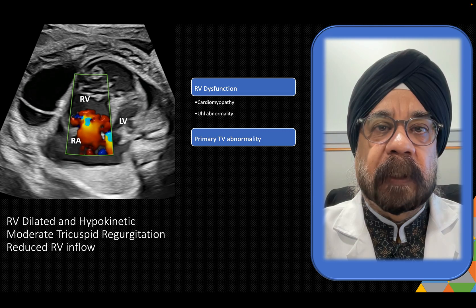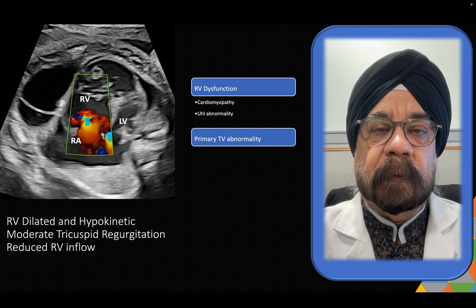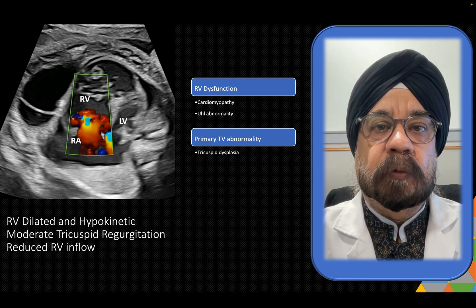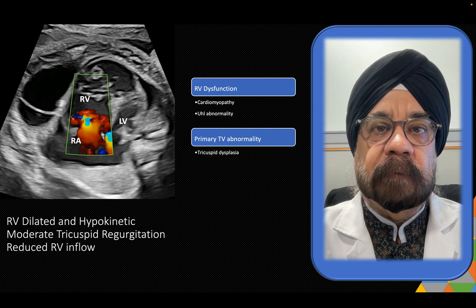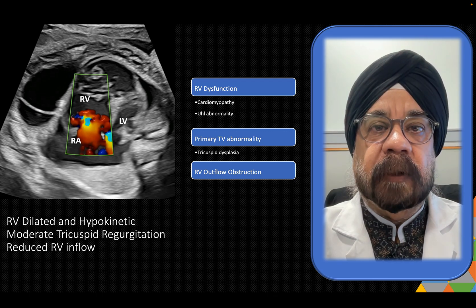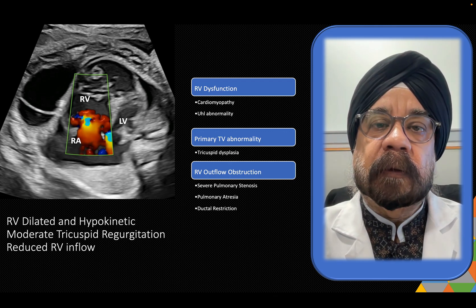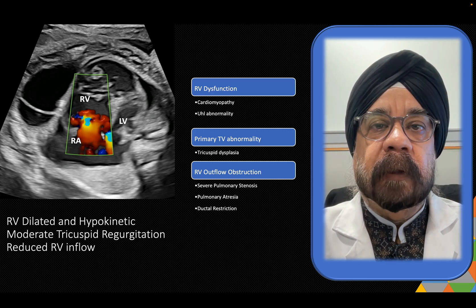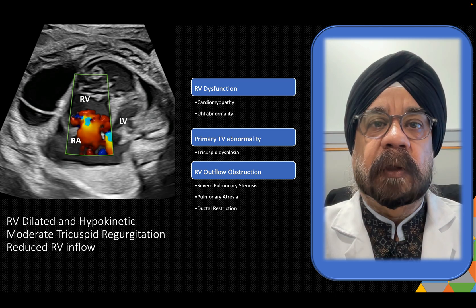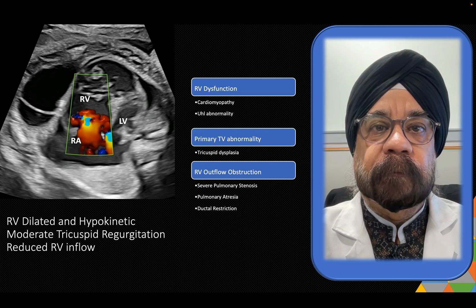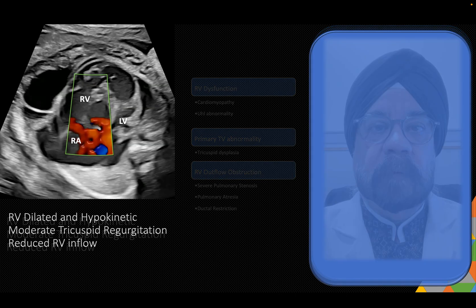Another possibility is primary tricuspid valve abnormality — either tricuspid dysplasia or Ebstein's anomaly. This doesn't appear to be the case here because the tricuspid valve looks fine. There could also be RVOT obstruction, such as ductal restriction or pulmonary stenosis evolving gradually. Pulmonary atresia is unlikely because the RV is generally small rather than dilated. So let us go one step further.